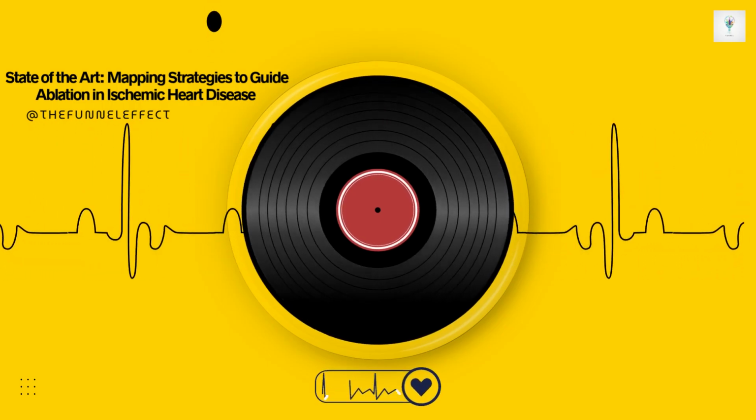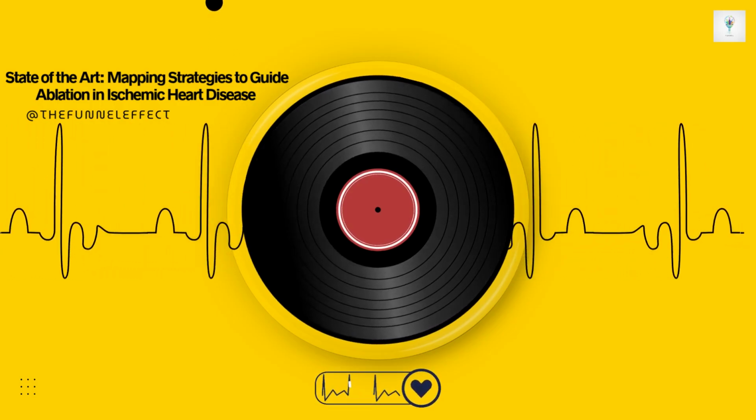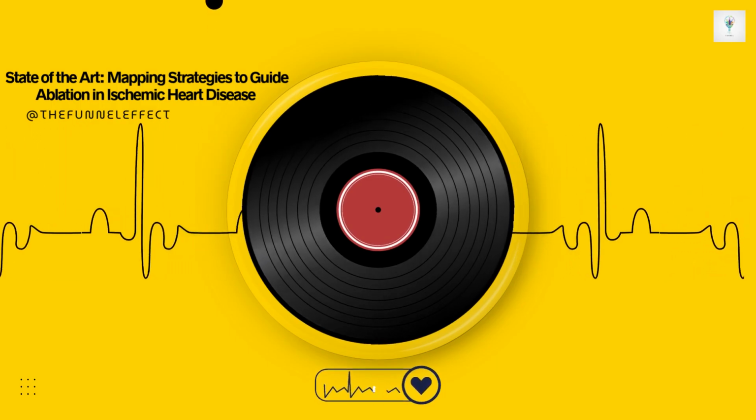So if bipolar voltage has this nearsightedness, it makes sense we'd need a tool with a wider view. That brings in unipolar voltage mapping. How does that help see the hidden scar?